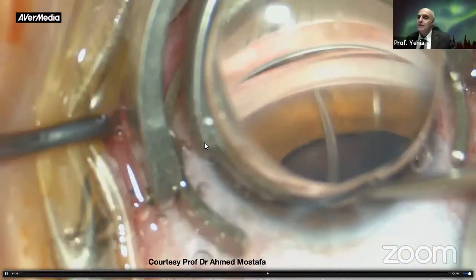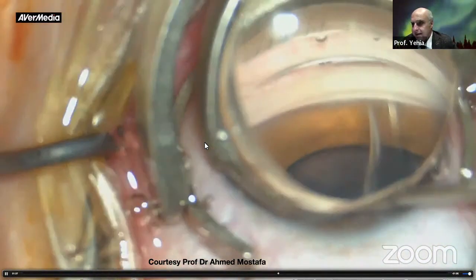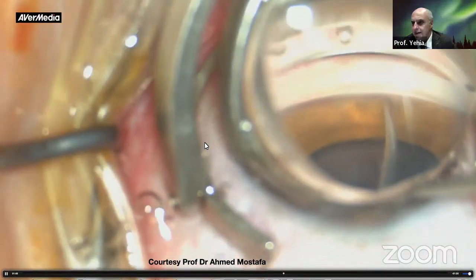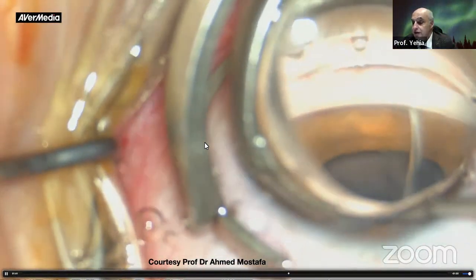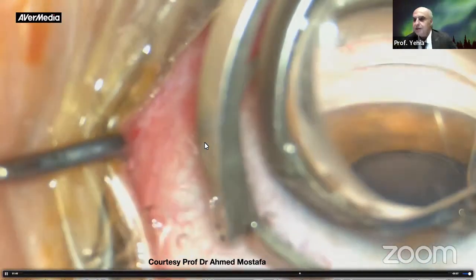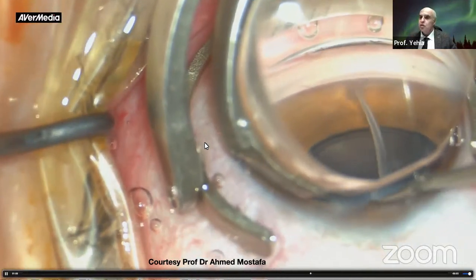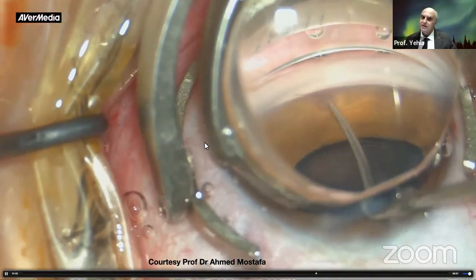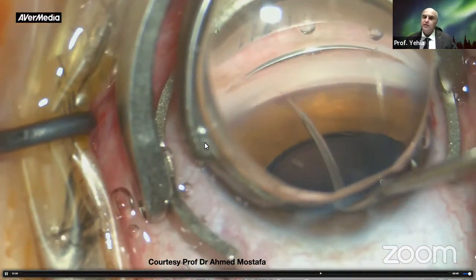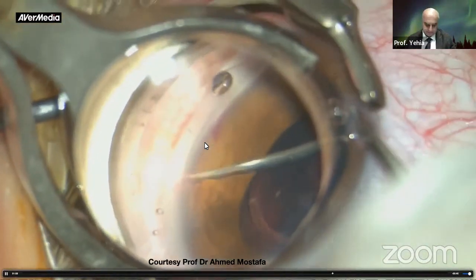The nice thing about this technique is that it doesn't need any expensive instruments. It's under vision. The results are very good. You don't need to do a trabeculotomy, trabeculectomy, any other complicated surgery. Just what you need to do is to open the angle. And usually these patients in the follow-up period for longer periods, they get very, very good results.